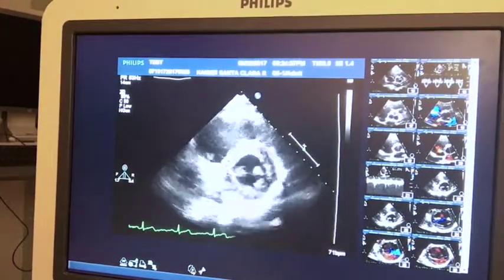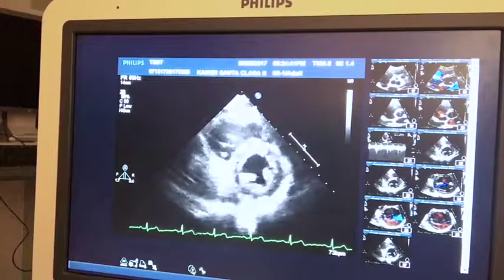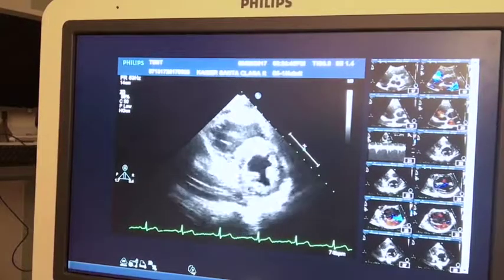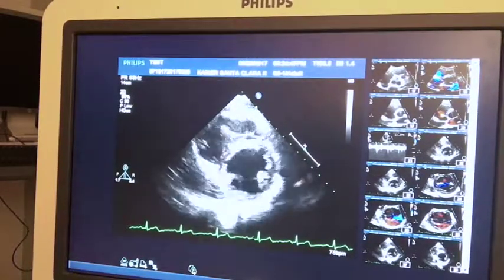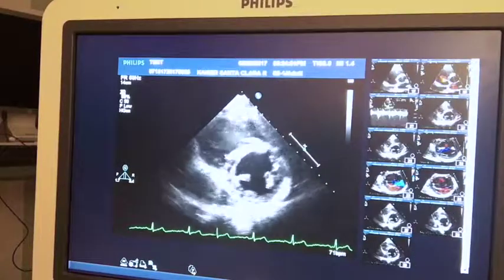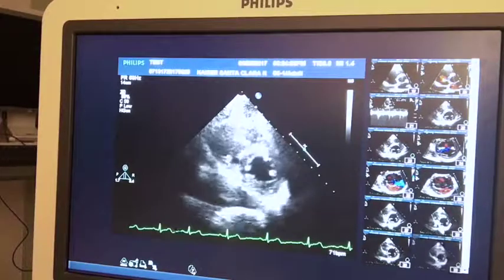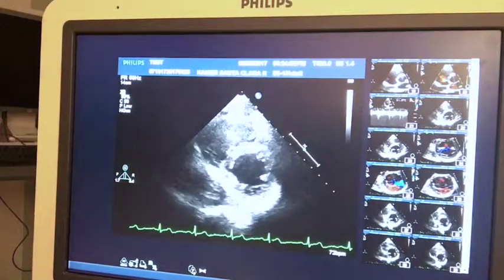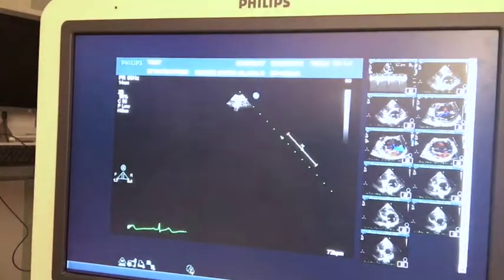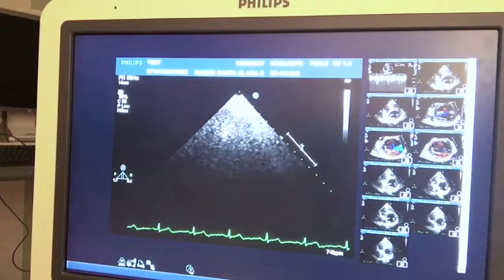And then we're going to go a little bit further south on the left ventricle. This is mostly your wall motion views, mostly your coronary artery questions about if there's an adequate supply, or if there's anything that's a regional wall motion abnormality, anything along those lines. And I march all the way down. I'm taking several pictures as I get all the way to the tip of the left ventricle. So that's a pretty quick walkthrough of the parasternal views.